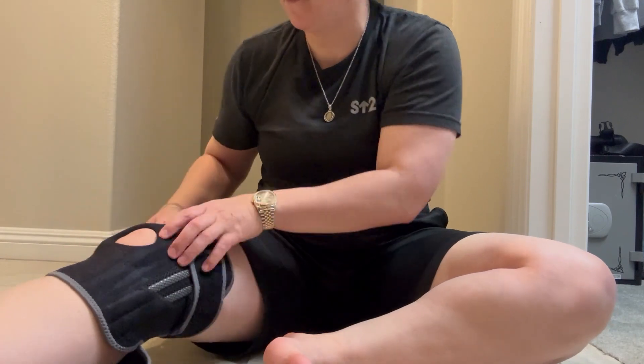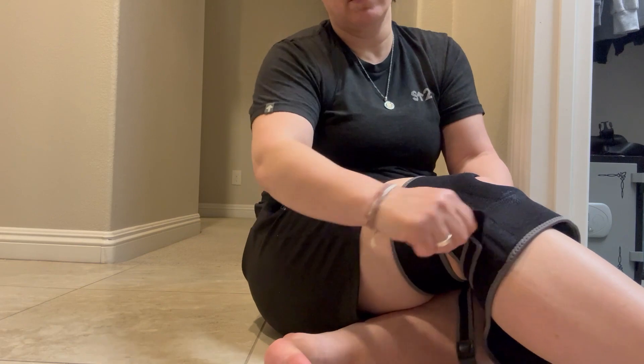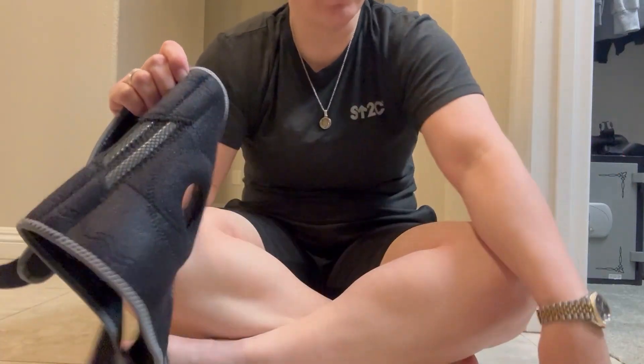So one, two, three, four. I very highly recommend this knee brace and I hope you enjoy it.